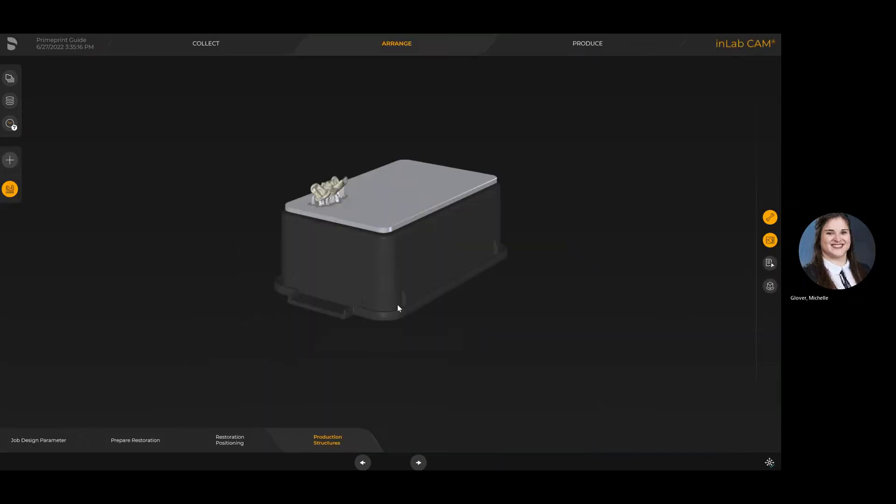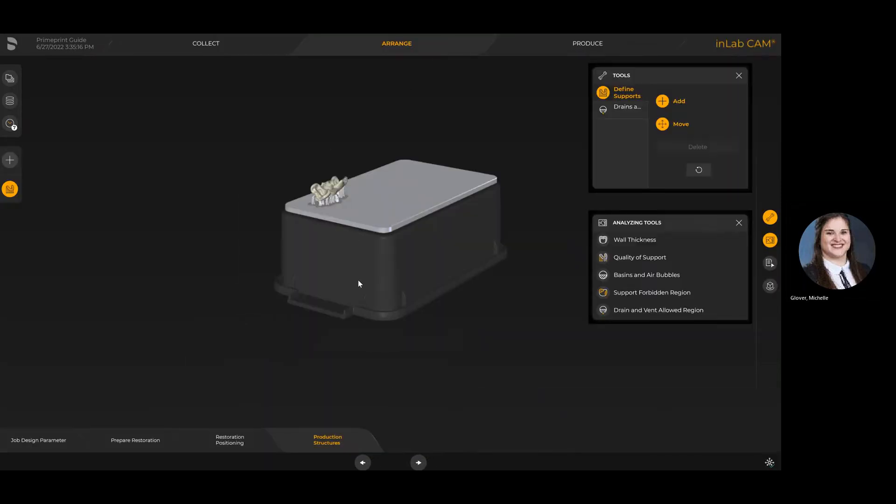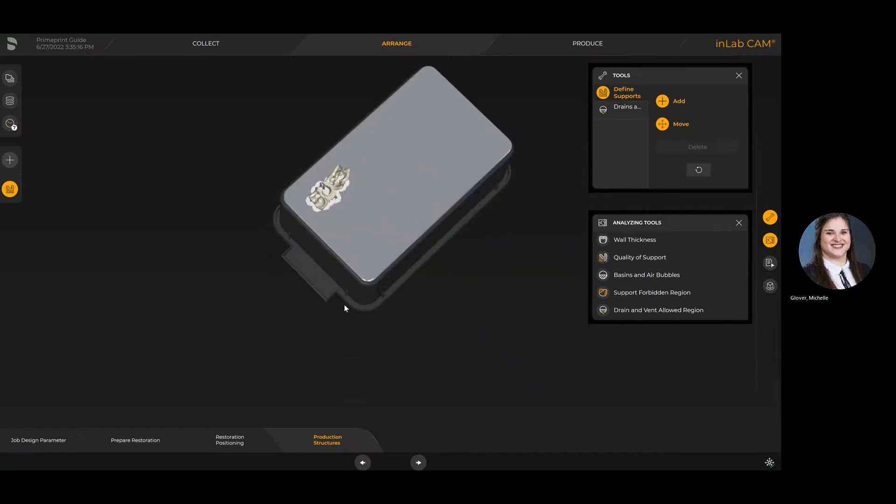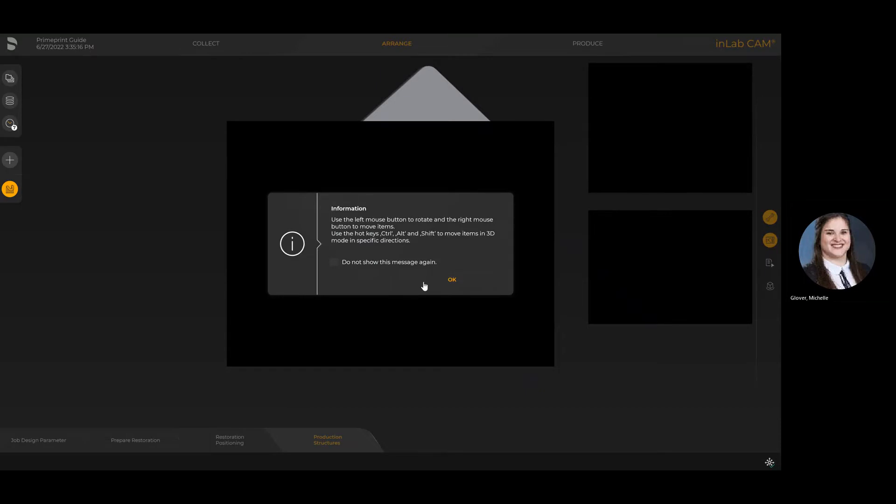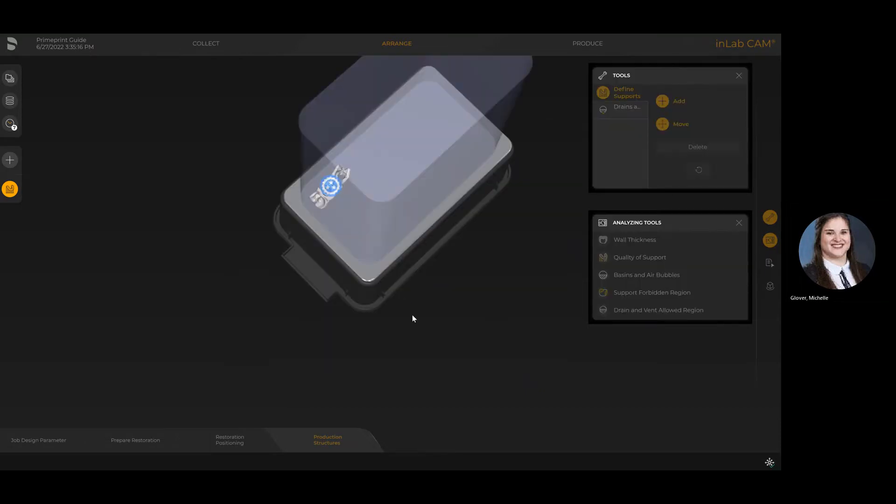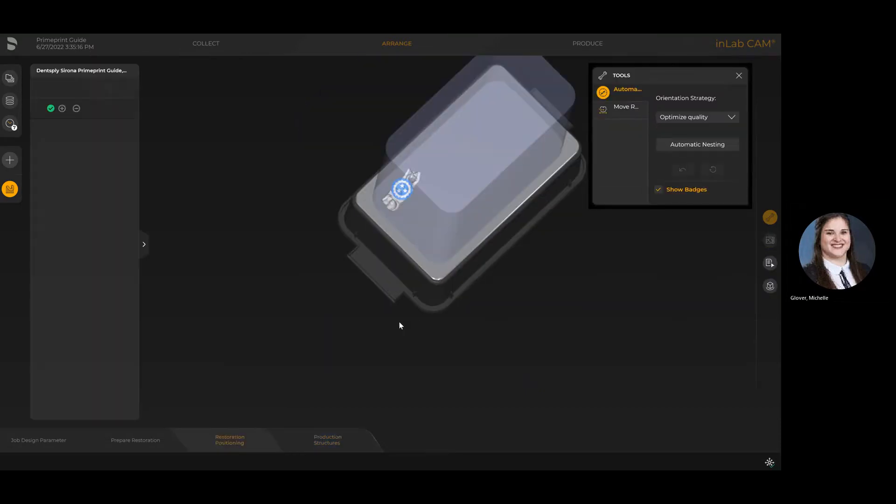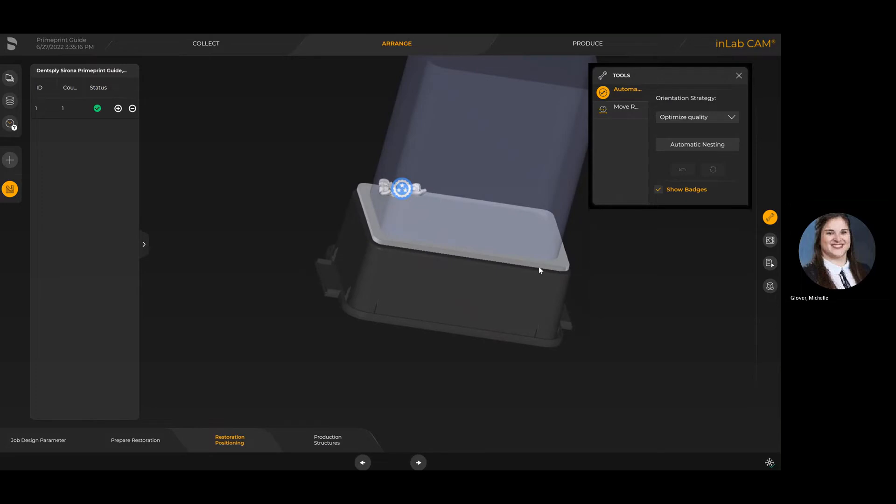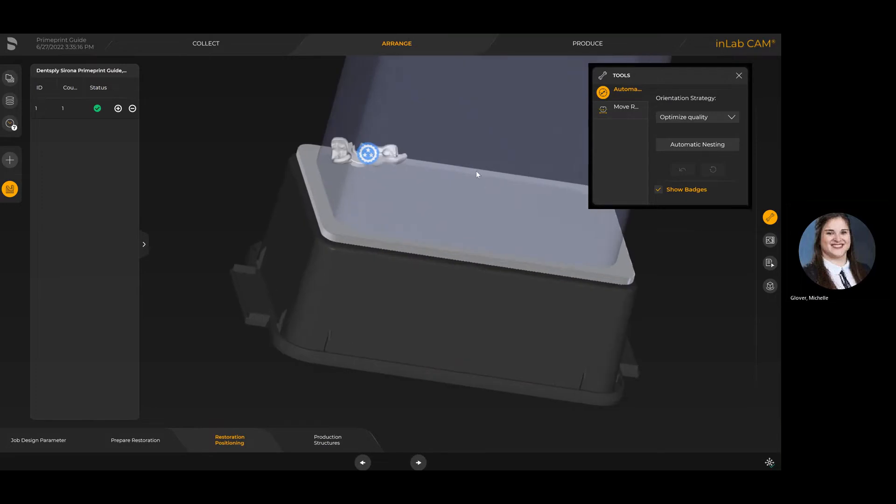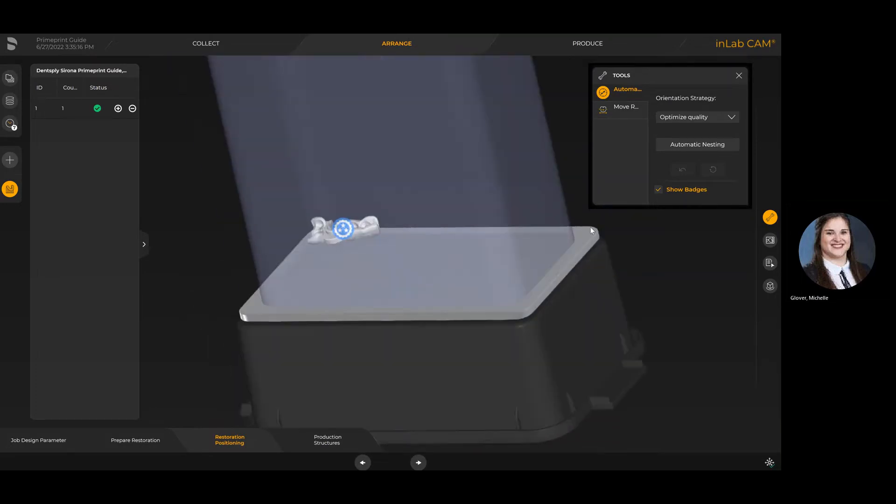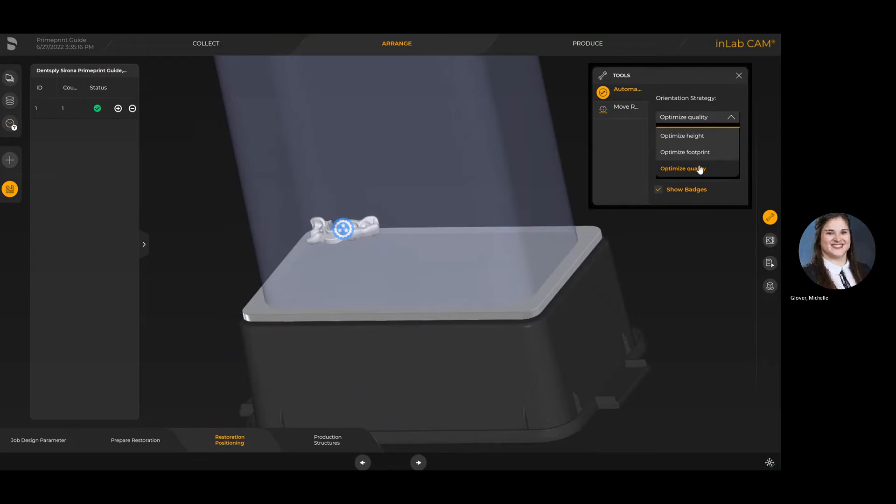However, I'm going to back up just a step here and go to the arrange stage. If I had gone through the motions of individual steps at a time, the next step would be the arrange where I would be able to do things like restoration positioning. When I'm in the positioning stage, the system has defaulted to optimum quality.